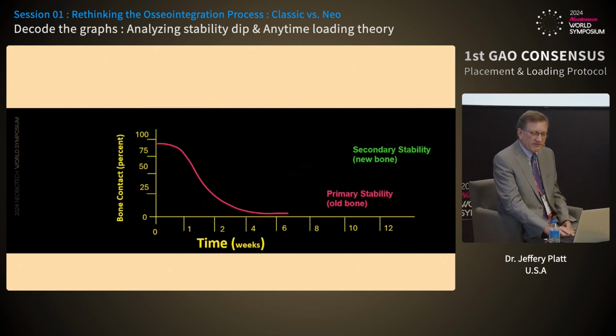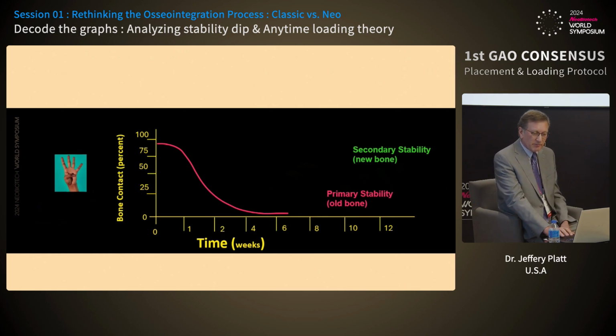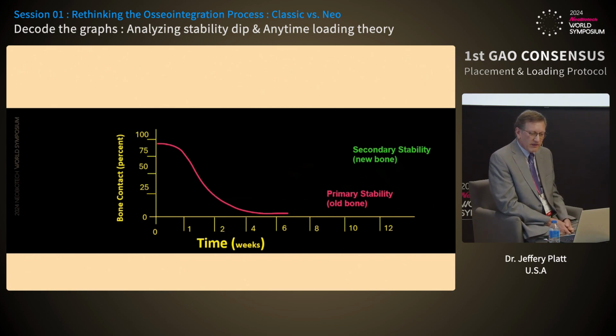Then the development of self-tapping implants came, and that created a loss of 4% more implants than was existing in the previous implants on the market. But companies sold the idea that you would save time in not having to do a tap drill because the implant was not having to be tapped and the thread design would tap the osteotomy itself. But in reality, we caused the primary curve to drop even faster than before or steeper than before.